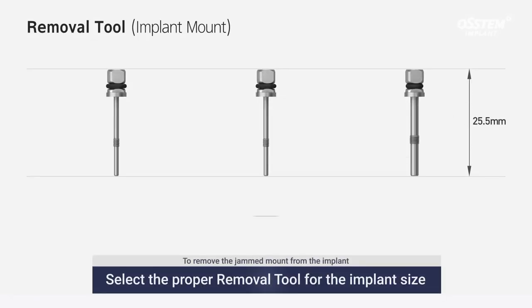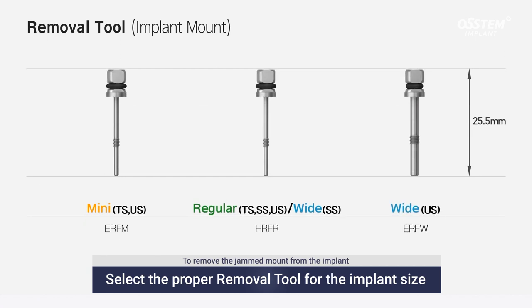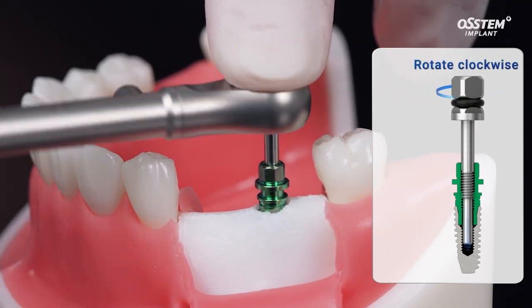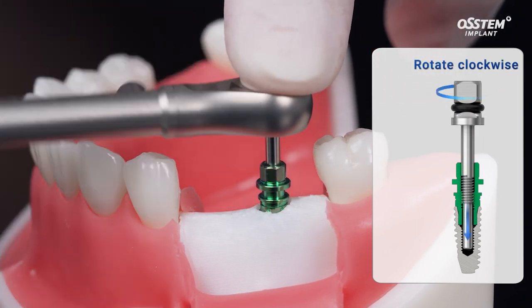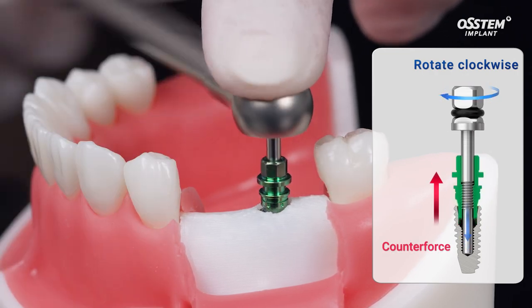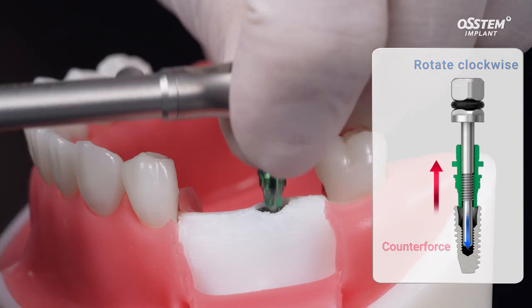To remove the jammed mount from the implant, select the proper removal tool based on the implant size. The jammed mount can be removed by the counterforce of the rotating removal tool when the tool reaches the bottom of the internal screw thread of the implant.